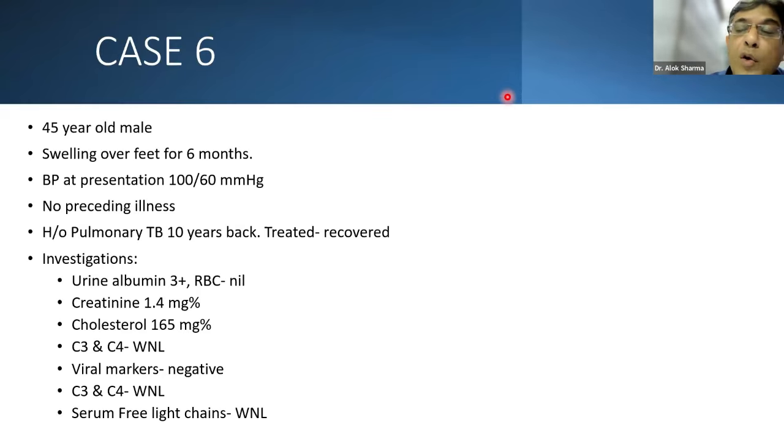It could be immunotactoid, it could be fibrillary. So you need to be sure whether those deposits are true conventional immune complexes. And I just told you about the dense deposit. Dense deposit is very bad news for the kidney, because it comes back. And till recently, there was no other way of doing it except EM.